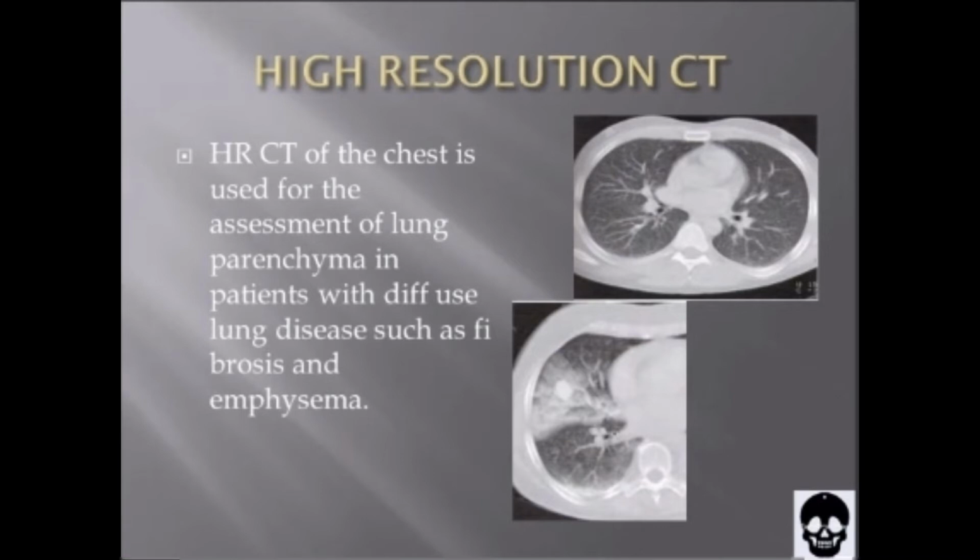In some situations, high-resolution CT protocols are incremental, meaning images are obtained with an interval of 10 mm or more between slices and only approximately 10% of the lung parenchyma is scanned. This technique is intended to provide representative areas of lung disease. However, because evidence of some types of diffuse lung disease may not be uniform in distribution throughout the lung, this method of sampling may result in characteristic foci of disease not being imaged.